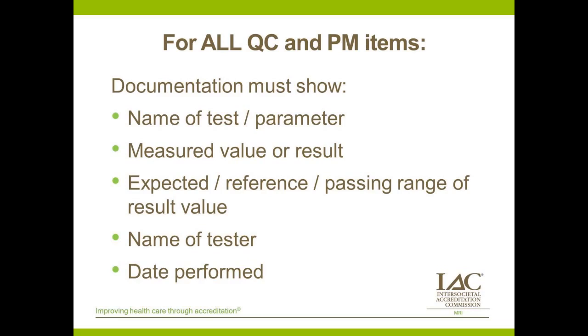And that's important because if you're using a preventative maintenance report from your MRI manufacturer service engineer, or if you're using a form that you've copied from the manual for your MRI system, it's important sometimes to be able to crosswalk those terms and say, okay, what we did is called X, and this actually fulfills something called Y under the IAC standards. And whether you can reflect that in your documentation or whether you're able to explain that, ultimately that's something that it's important for you to be familiar with in your MRI facility in order to be able to discuss that with the IAC program staff.